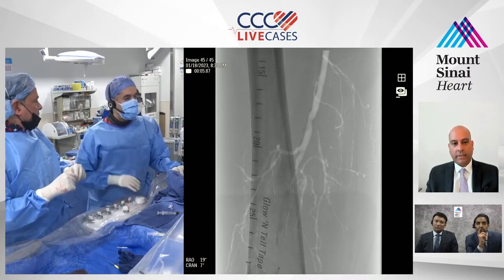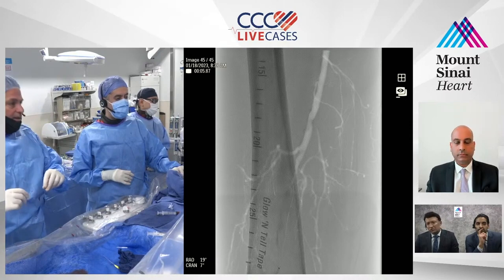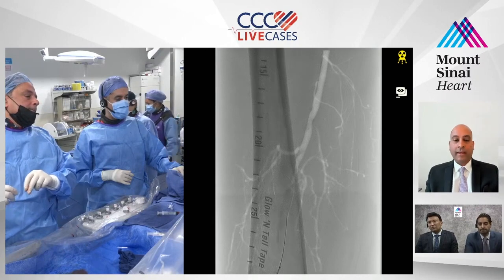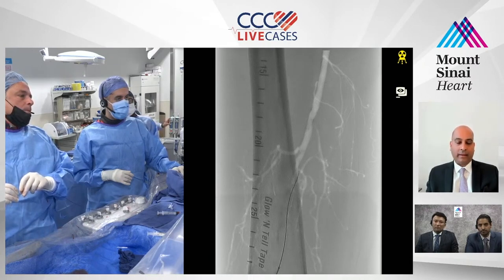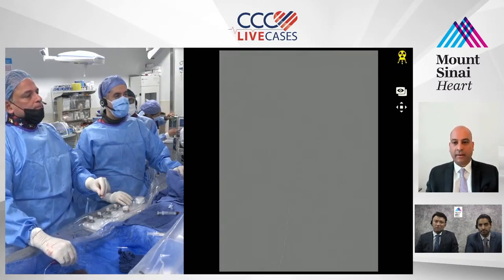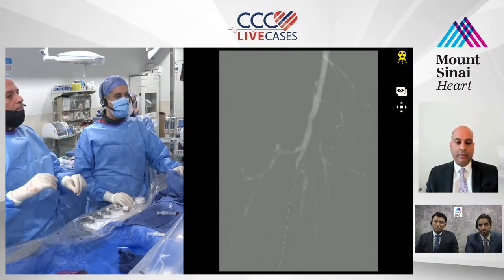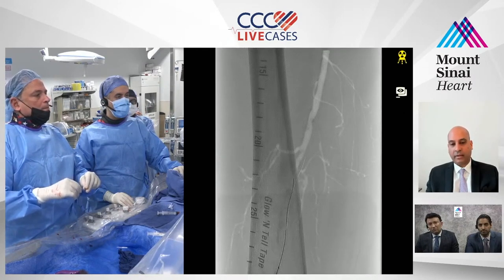I pulled the catheter back, so I'm going to get the Outback ready. You usually tend to access the occluded vessels in the pedals as much as possible. In this one, as PK was saying, it's a very heavily calcified posterior tibial artery that's occluded. That's going to be very hard to cross. If it's relatively non or minimally calcified, then it's easier to do the so-called Schmidt technique, where you access an occluded tibial and use that as your conduit for therapy above. But in somebody who's heavily calcified like she is, the likelihood of crossing that PT is going to be tough just from below.